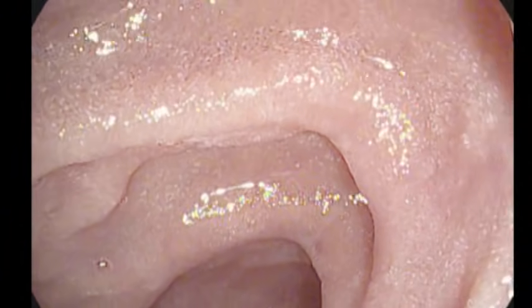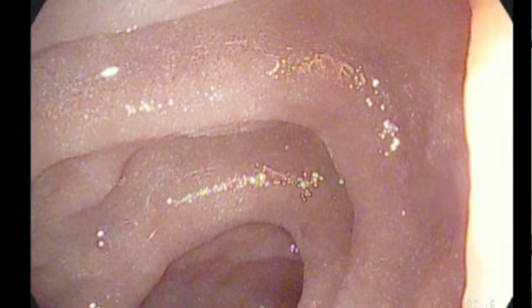There are 3 specialized modifications that work to increase the surface area of the small intestine. These include villi, microvilli, and plica circularis. Intestinal villi are finger-like projections that extend about a millimeter from the mucosal surface into the lumen. The villus structure of the intestinal mucosa contributes to the velvety appearance seen at this magnification.